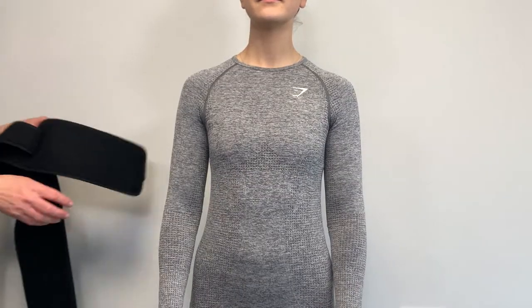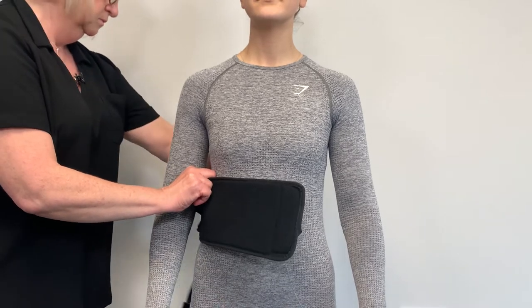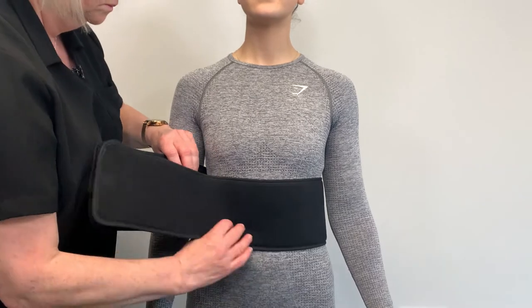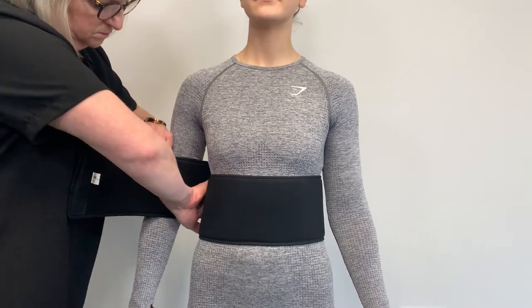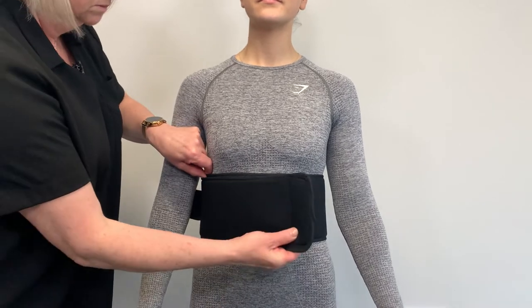Wrap the swathe around the patient so that the humeral cuff is on the side of the affected arm. The swathe fastening overlaps at the front. If the opposite arm is required, simply invert the swathe and the shoulder strap assembly.